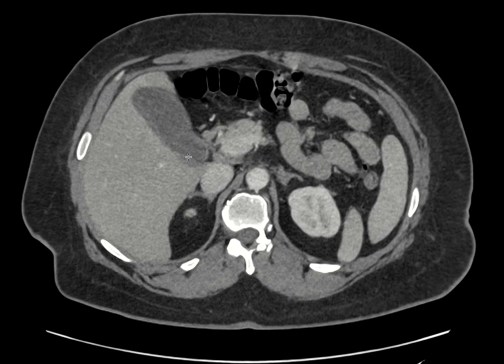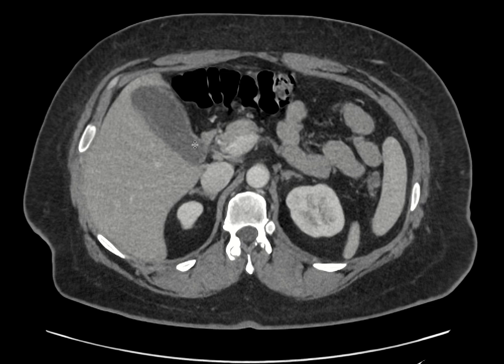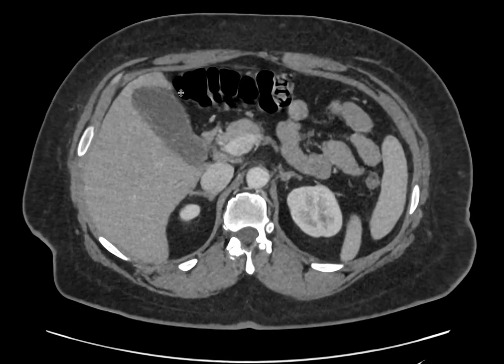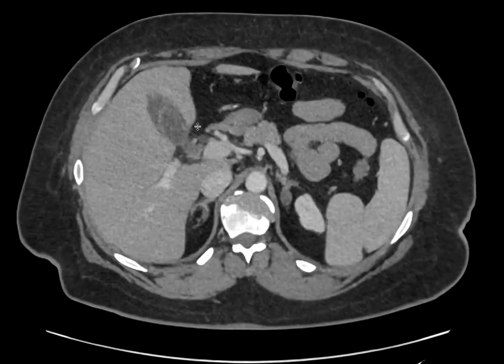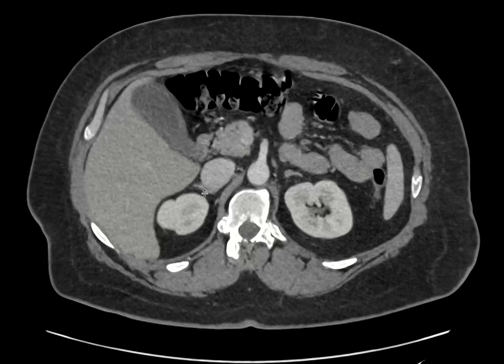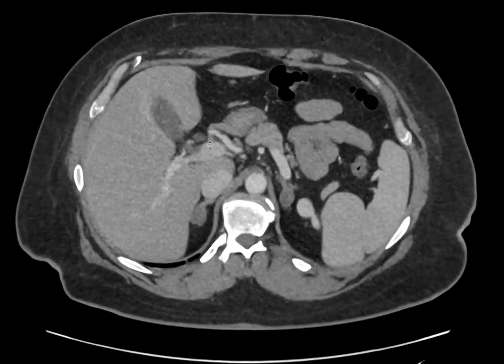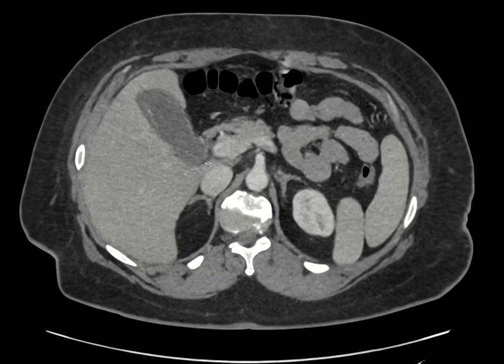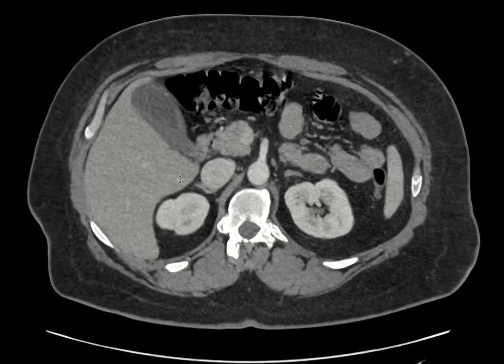This particularly happens in cholesterol gallstones, and so the sensitivity of CT in being able to assess for gallstones can be quite low, especially for cholesterol gallstones. It does a much better job in calcified gallstones, and those are not difficult to see by CT scan, but you can get large gallstones within the gallbladder and not be able to see them on CT scans.